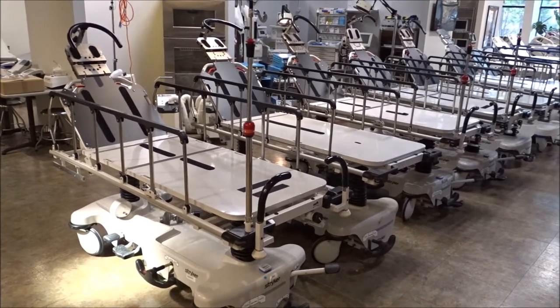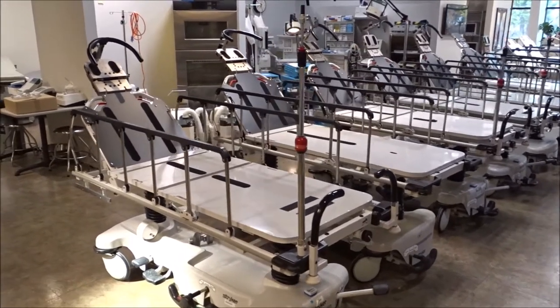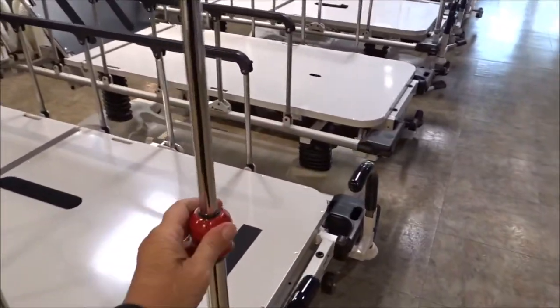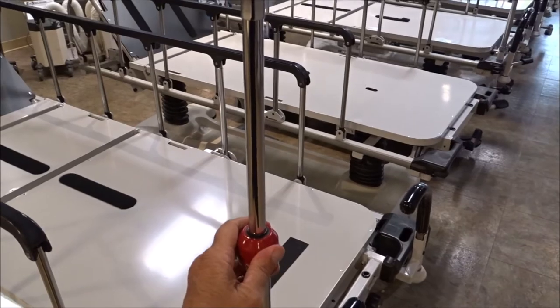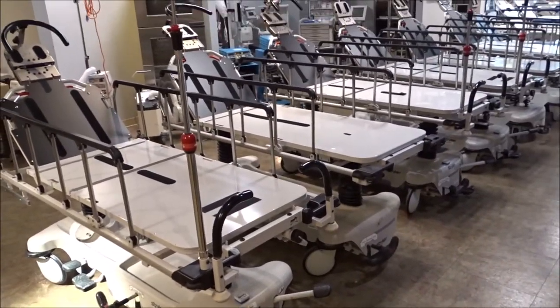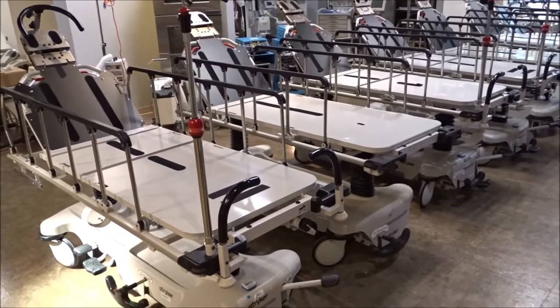The Stryker eye stretchers come with optional features. The IV pole here at the bottom is an optional feature, so those come with some of the stretchers, but as you go through here, you'll see that different hospitals equip them different ways.